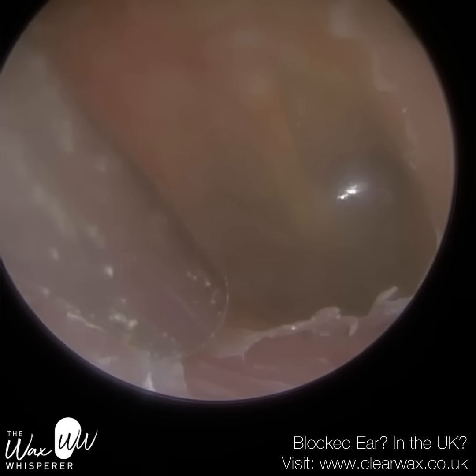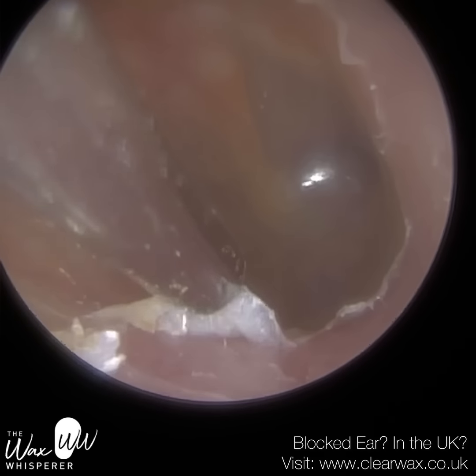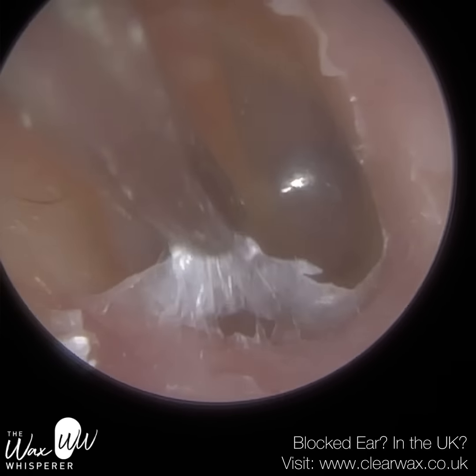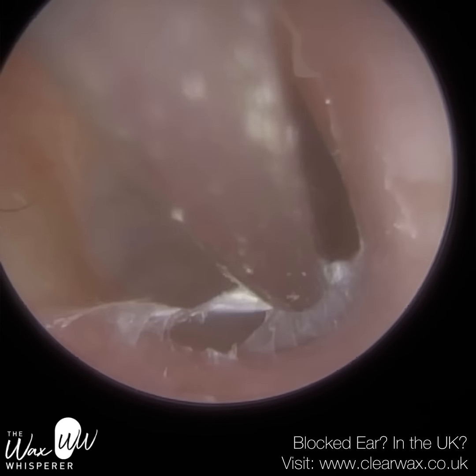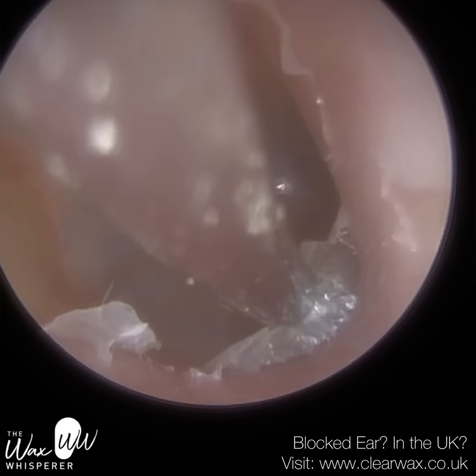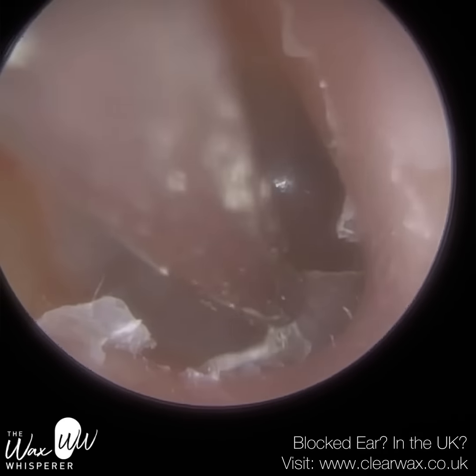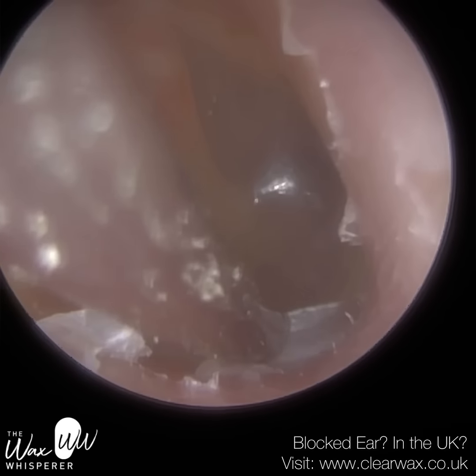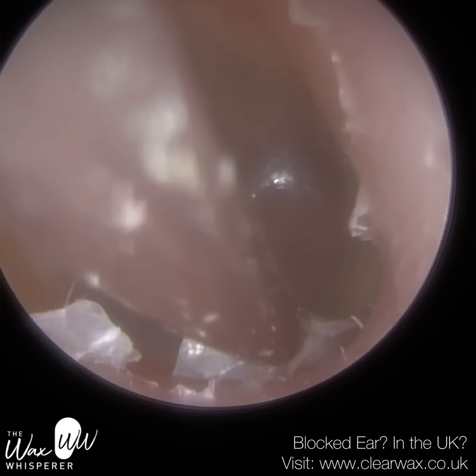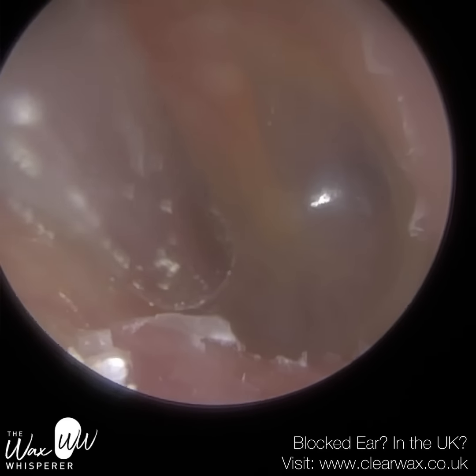Now, just the other day, I accidentally burnt myself. I held a hot pan, and about a week afterwards, during the healing process, some of the skin in that area, just like in this patient's ear, this outer layer of skin, began to separate, and I had to peel it away. It wasn't coming away by itself as it usually would. It was attached, so I had to peel it away. That's a similar thing, but obviously this patient's ear wasn't burnt, it's more to do with how this skin that I'm peeling looks.